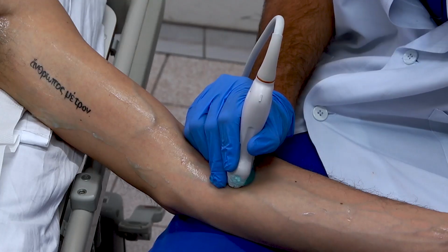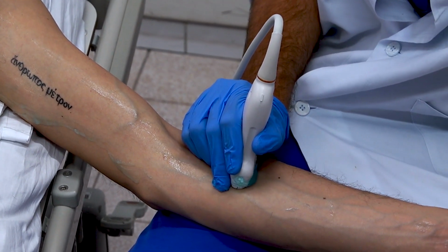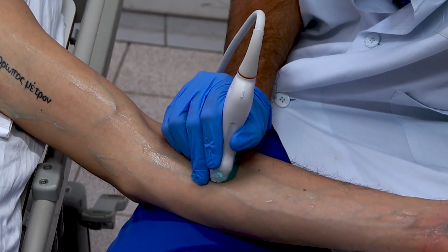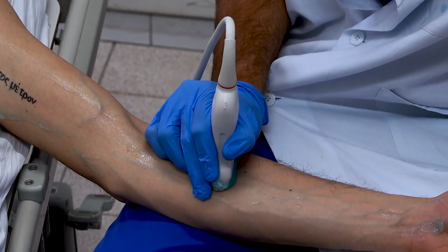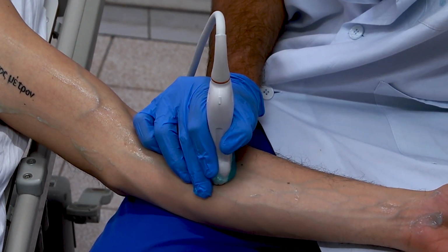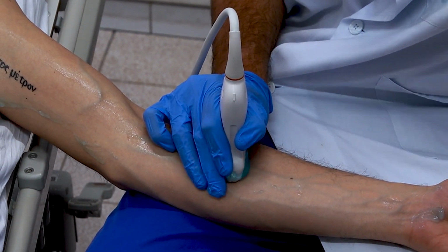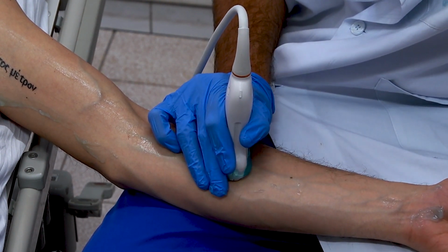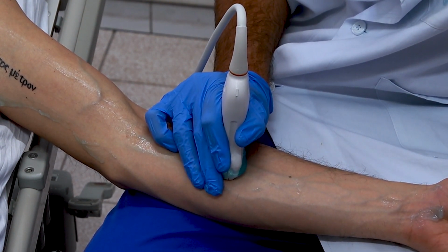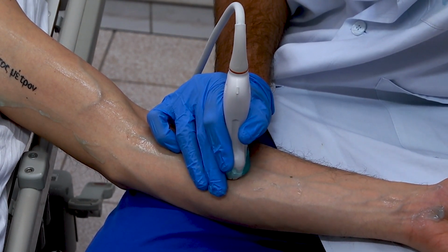The median nerve then penetrates the pronator and is located between the two heads of the pronator teres muscle, as you can see in this image. And this is a possible site of entrapment of the median nerve, mostly related to muscular hypertrophy.